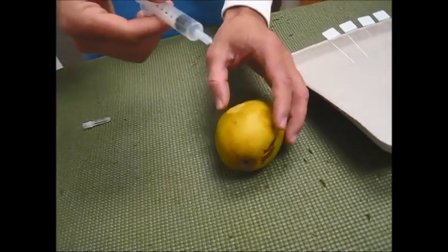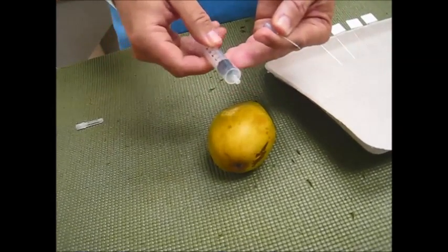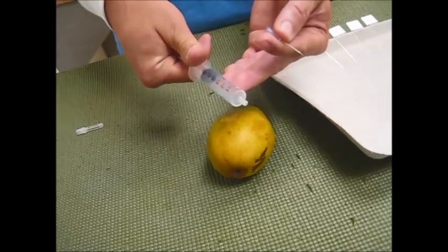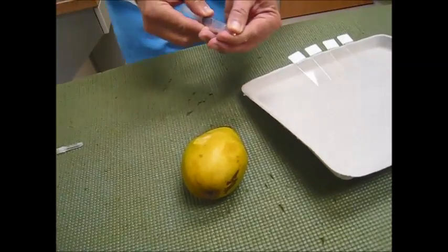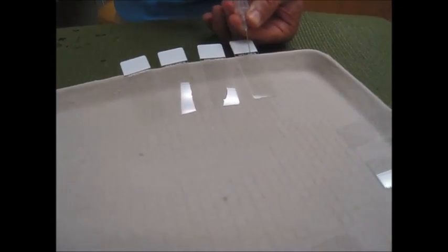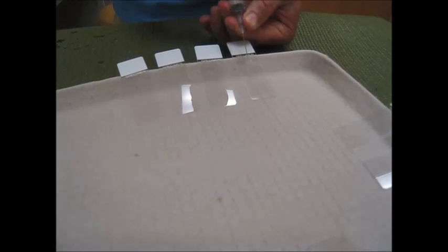Remove the syringe and needle, take the needle off of the syringe, pull air all the way back to approximately the 6 cc mark, reattach the needle, take the tip of the syringe close to the slide and in one forceful movement eject the aspirated material.